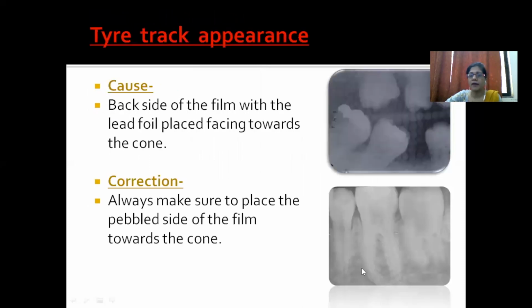Now the tire track pattern. This is the tire track pattern, and this is a honeycomb pattern. All these patterns are because of the lead foil which is placed on the backside of the film. The film packet itself contains the lead foil.